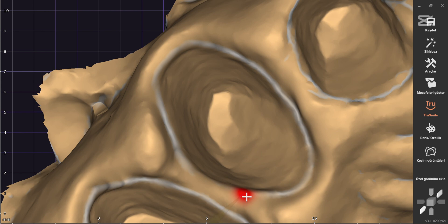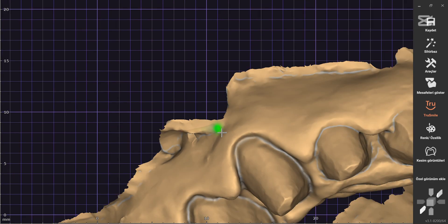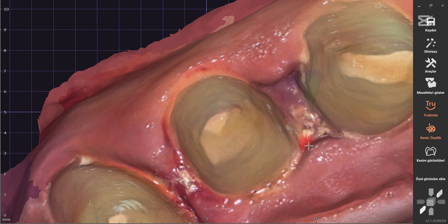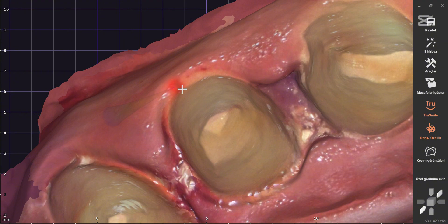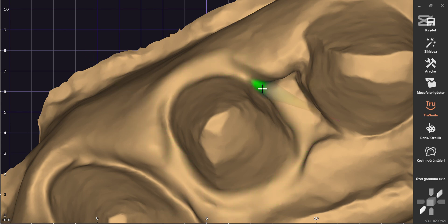Cleaning the digital impression is a critical step to ensure the design process proceeds smoothly. Using appropriate software tools, we remove any excess material and correct scanning errors. It is essential to eliminate unnecessary elements without disrupting the anatomical structure. If there is excess material or incorrect scan areas, we refine them to make the impression ideal for the next steps.